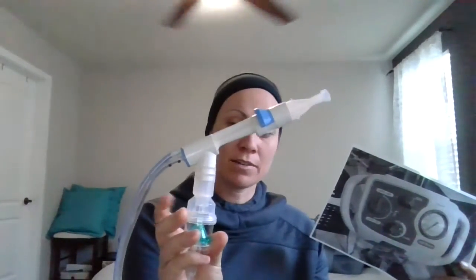For my patient, I'm going to instruct them that they need to sit upright and create a tight seal around this mouthpiece, and they need to breathe through their mouth, not through their nose. If they're having trouble breathing just through their mouth, we have a little nose clip we could put on them. I'll put the medication in here. If we're not doing any medication, we just use regular saline.